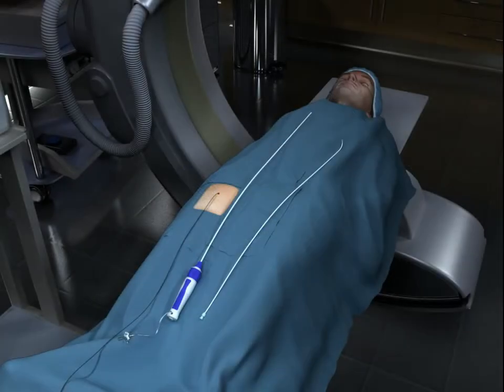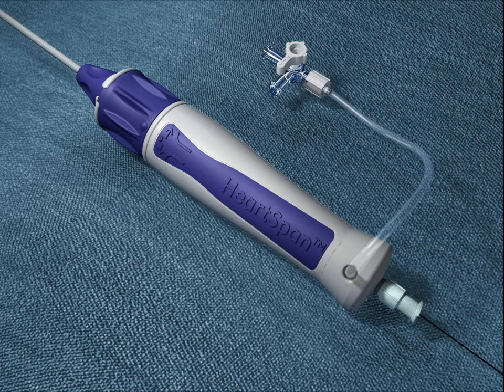The HeartSpan Steerable Introducer has been designed to deliver ablation catheters, which are used to treat irregular heart rhythms safely and effectively to the target location.